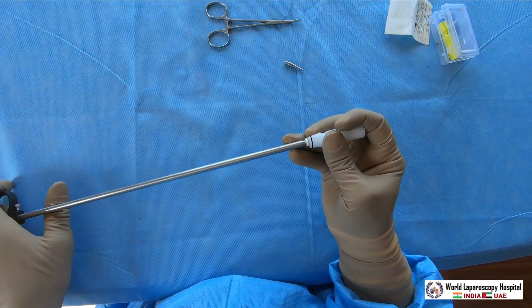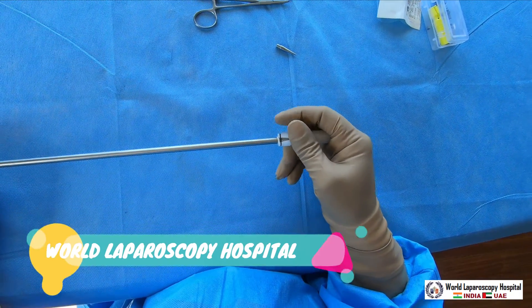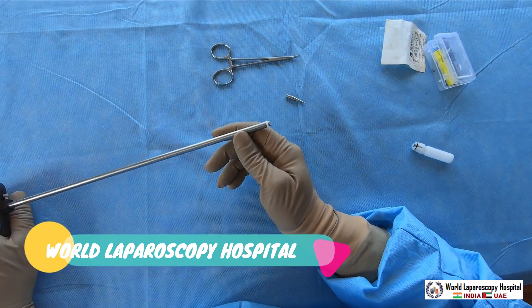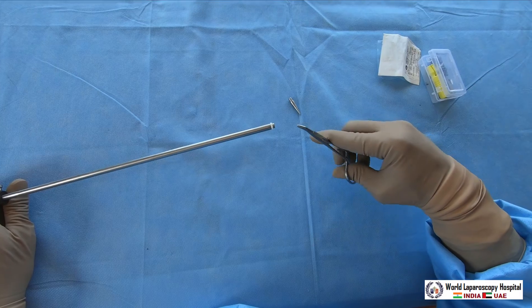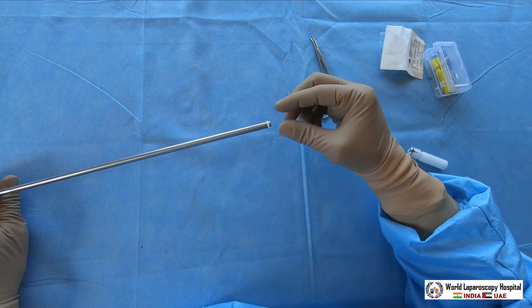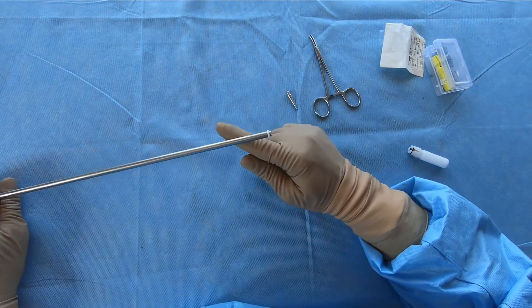During pushing, make sure you don't allow the ring to slip off. Once loaded, it is done. There is a technique to doing this correctly — some people use a mosquito forcep to hold the silicone ring, but never do that. It will destroy the elasticity and your sterilization will fail.